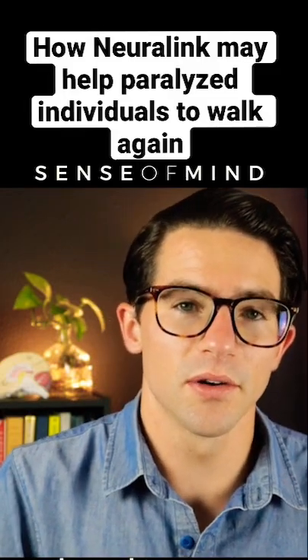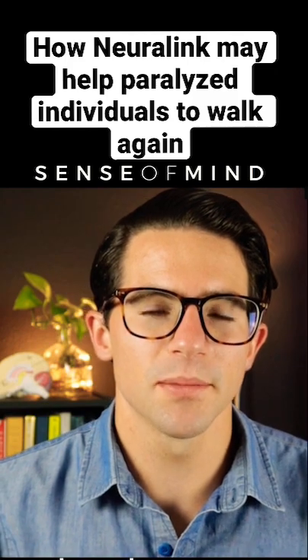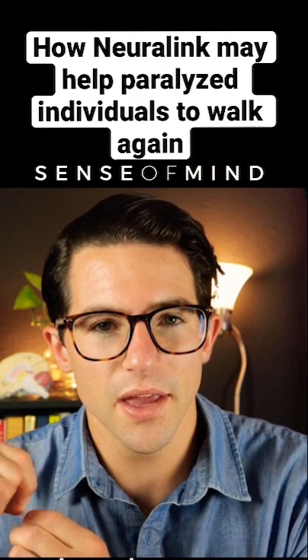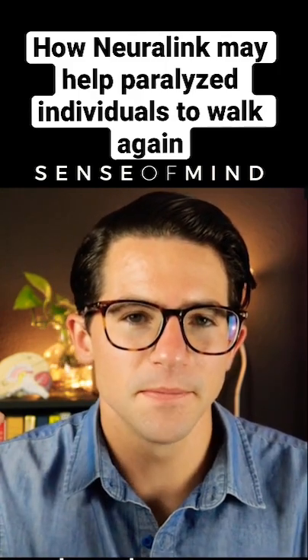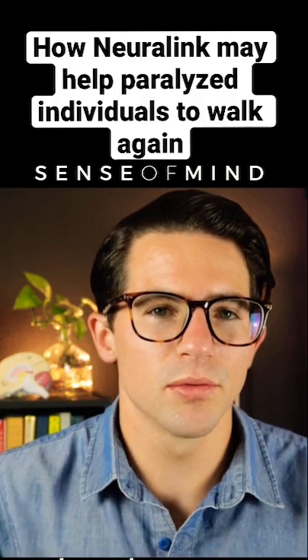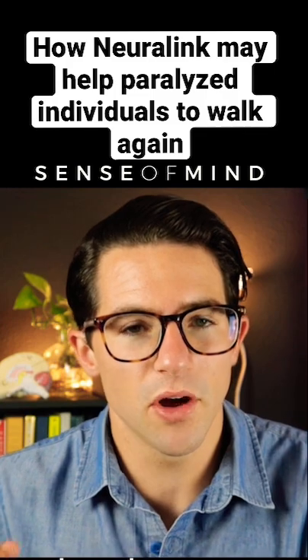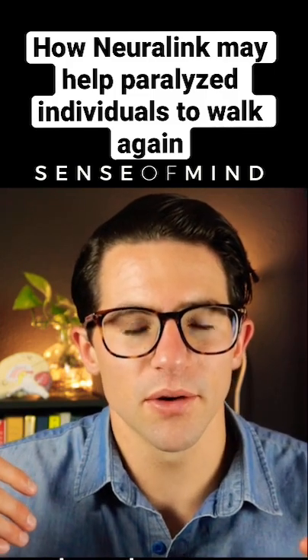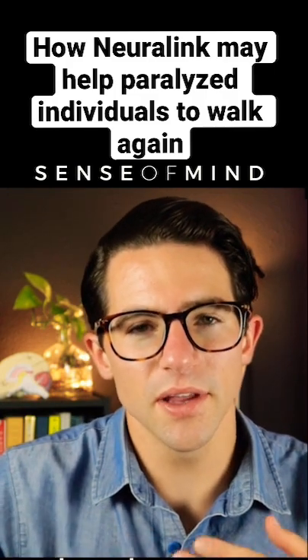To understand the Neuralink technology, you have to understand something called single unit recording. Microelectrodes — really thin wires — are inserted into the brain and can be used to record the activity of small populations of neurons. They're inserting not just one microelectrode but thousands, and then they can decode that activity.